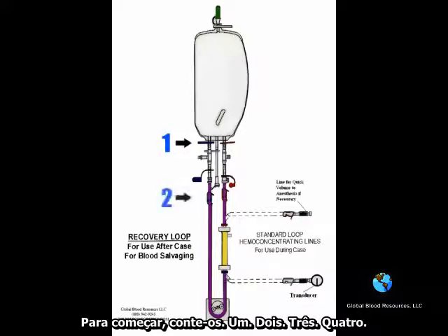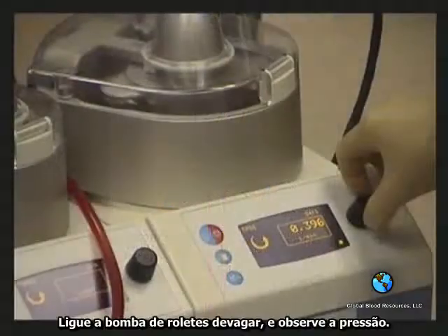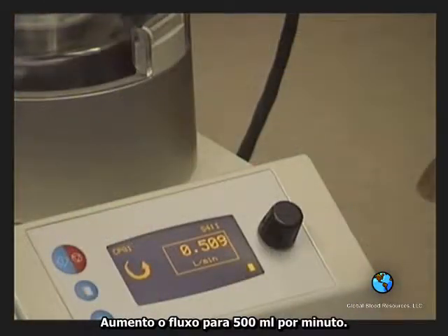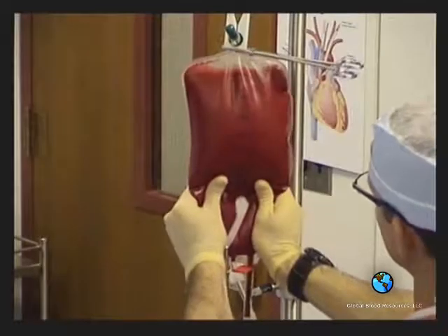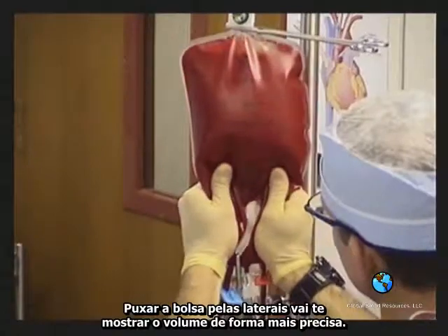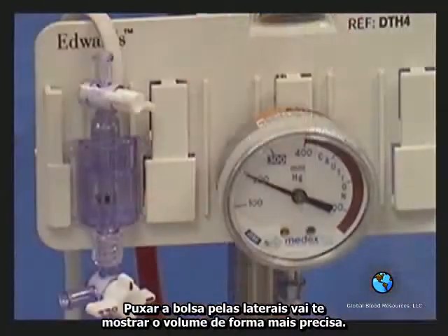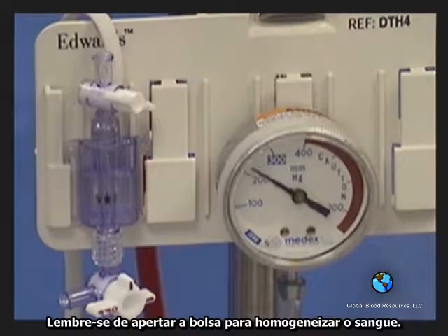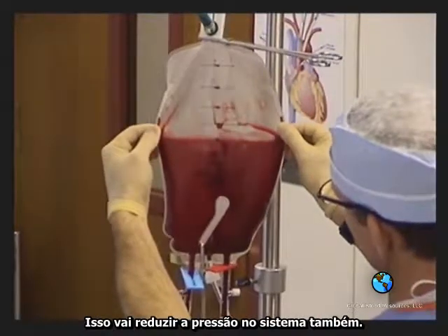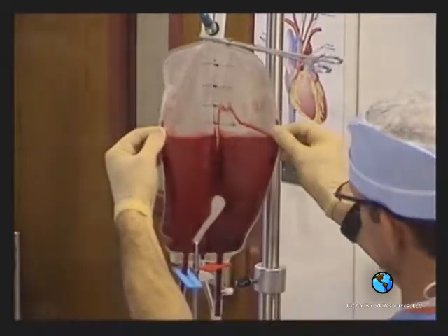1, 2, 3, 4. Slowly turn on the roller pump and observe the pressure. Bring your flow up to 500 mL per minute. Squeezing the bag periodically is important, and pulling the bag from side to side will show you the volume accurately. Remember to squeeze the bag for better admixture. This will reduce the pressure in the system as well. Non-cellular water is removed quickly, as you can see by pulling the bag side to side.